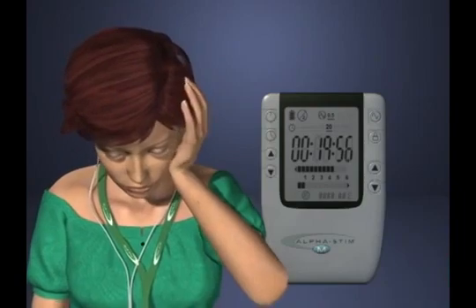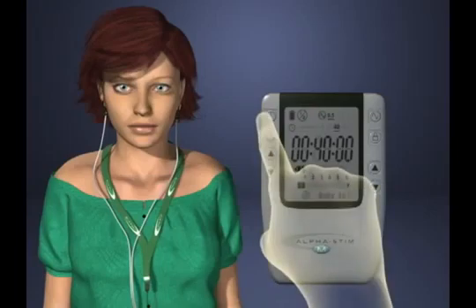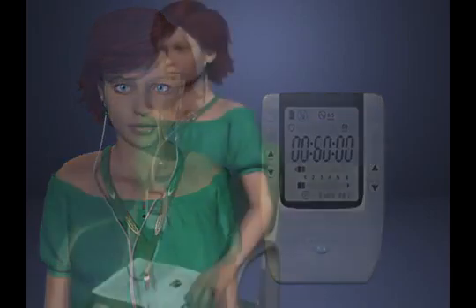Increase the current slowly until a dizzy feeling is experienced, like rocking on a boat. Then decrease it immediately until the dizziness stops. Also decrease it if the normal tapping sensation felt on the earlobes becomes uncomfortable. For people who have a history of experiencing vertigo, which means dizziness, such as motion sickness, treat at a current setting of 100 microamperes for 1 hour or more to prevent residual vertigo after treatment.